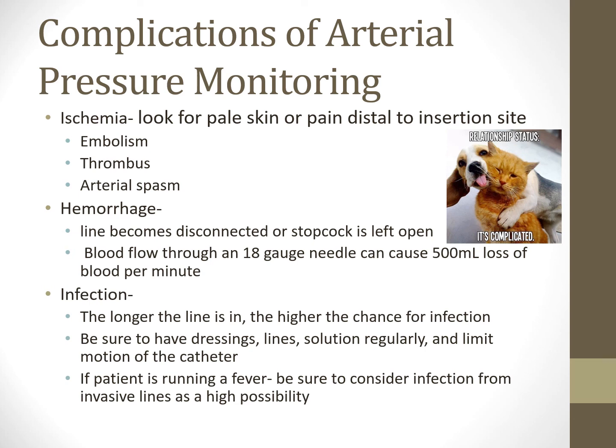how many people every time they go into the room are going to be looking at this patient's femoral location? Not many, and so it's not as widely checked upon as the radial site, or visible as the radial site, hopefully. So that's something that we have to be very cognizant of. Hemorrhaging is a big thing that we have to be careful of, especially if they have low platelets, for sure.